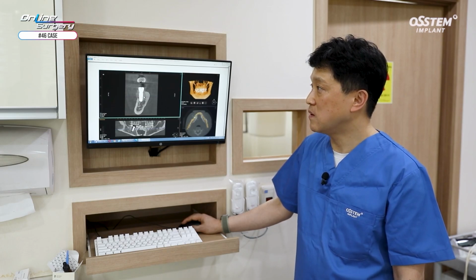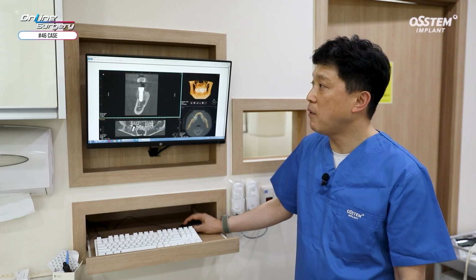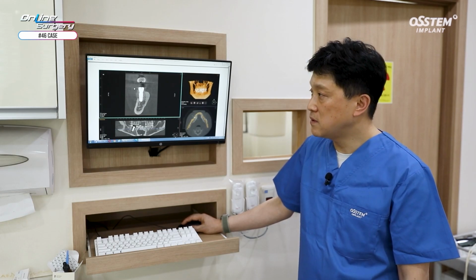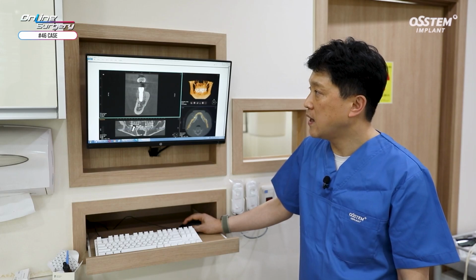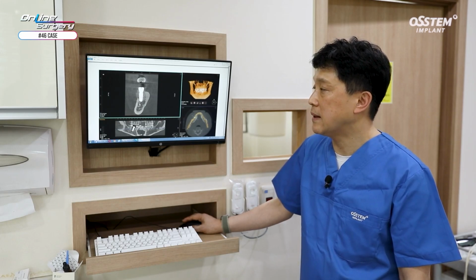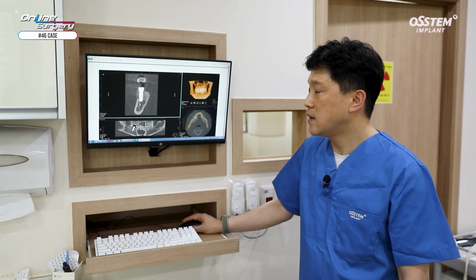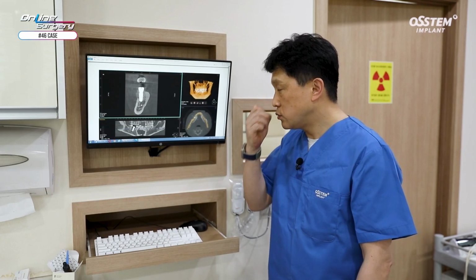More so than the desired position, it has been placed more buccally, but membrane stabilization was done as well as internal and external socket graft. Hence, I think it will not affect the long-term stability of the implant nor the prosthodontic steps. Significant bone regeneration was required for this patient, so prosthesis will be delivered post-op 16 weeks.